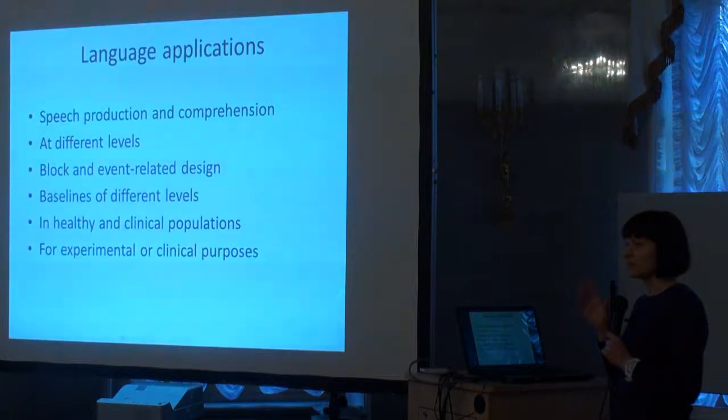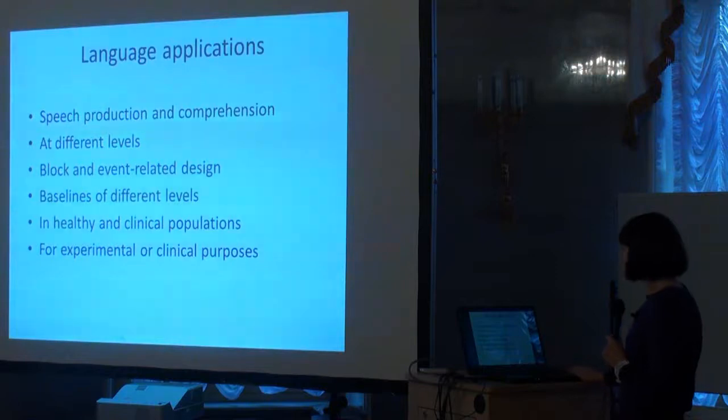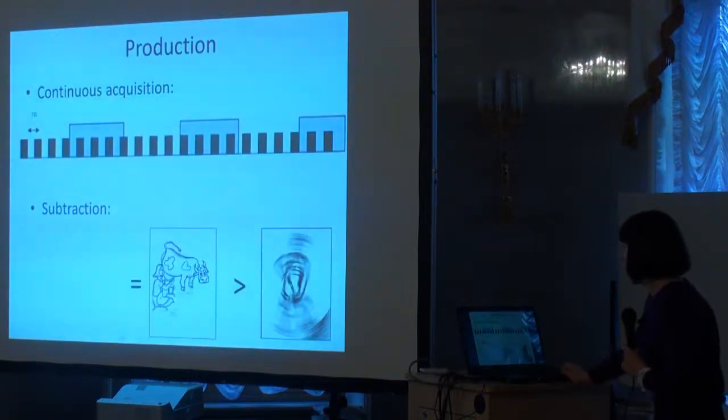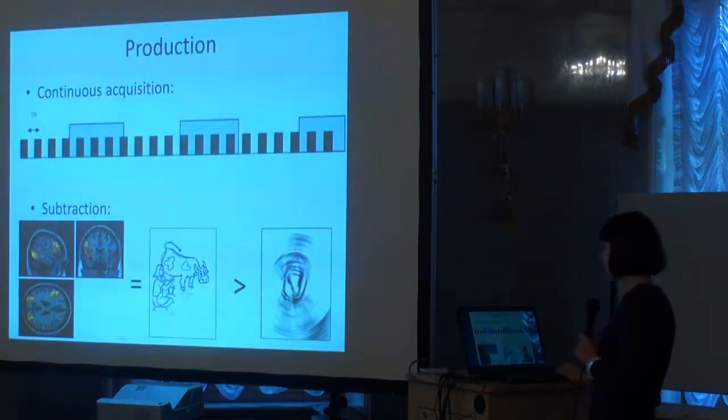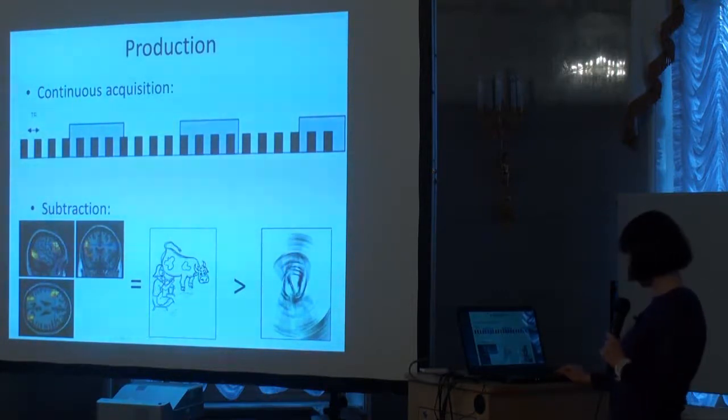For example, you study word retrieval, and you want to subtract motor response, visual analysis, whatsoever. And fMRI can be used, of course, for experimental purposes, as we do, but it also has some clinical promises. I will give you an example of a continuous acquisition and block design.